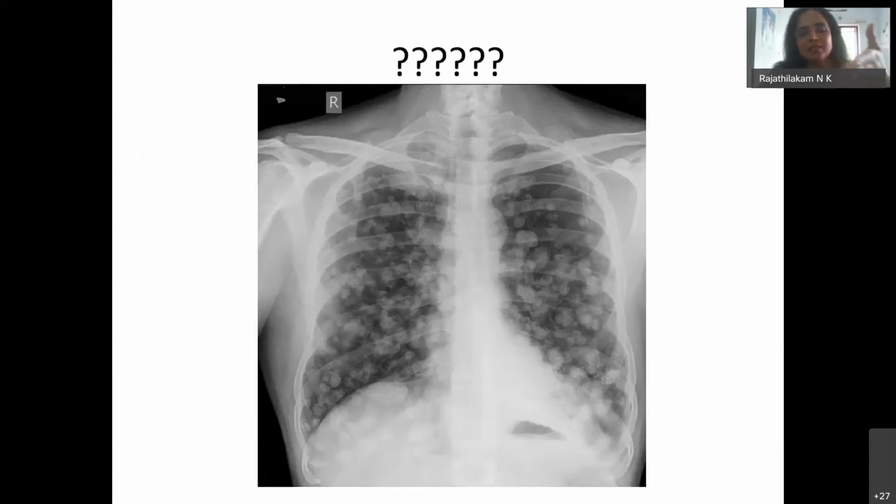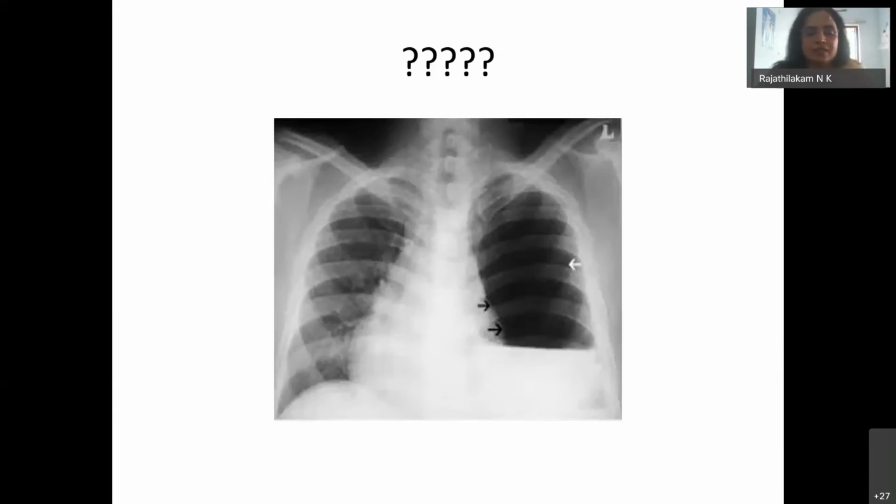This is metastasis, cannonball appearance. Next slide. Can you conclude? This slide is hydropneumothorax. Next slide is thanks.